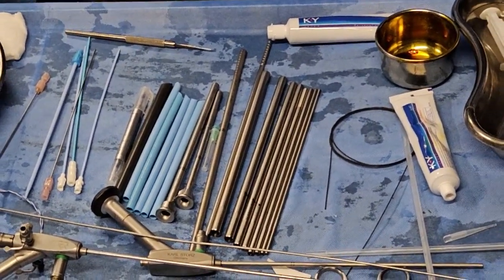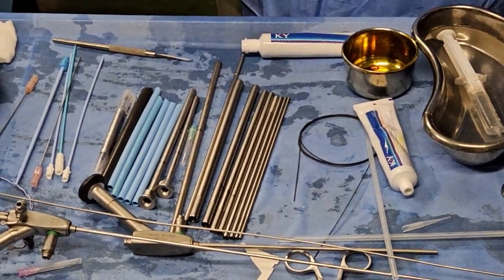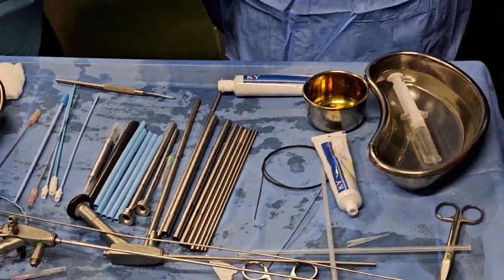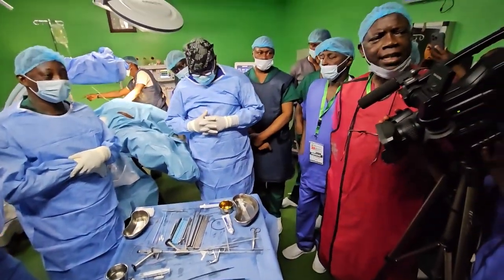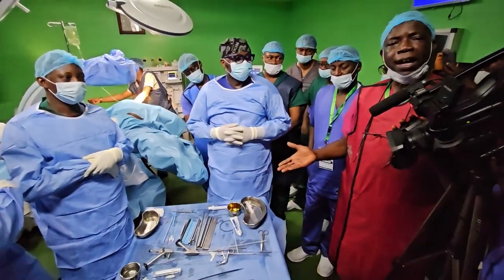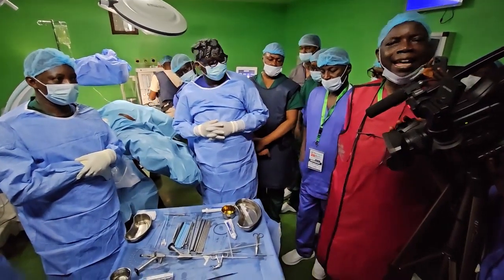If I may just quickly make a point, Professor Alken is a very big historical figure in the story of PCNL. He started it, was it in Germany or in Switzerland? I don't remember. Germany. So he started it and developed this. It's named after him, Professor Alken dilators, A-L-K-E-N.